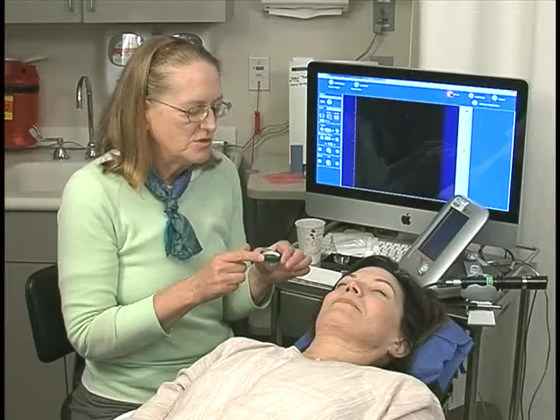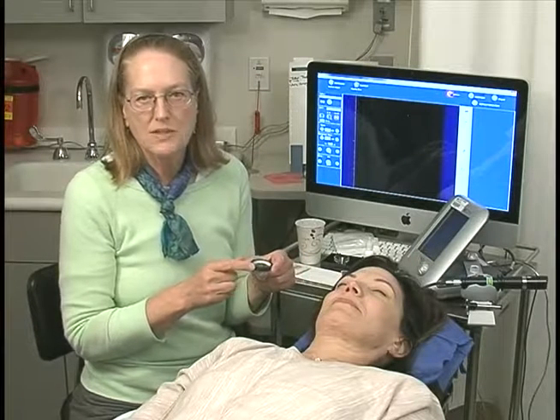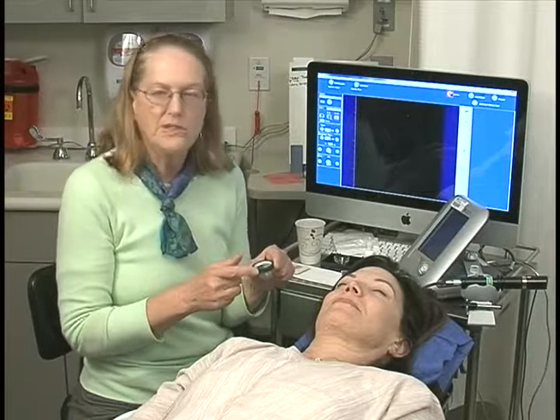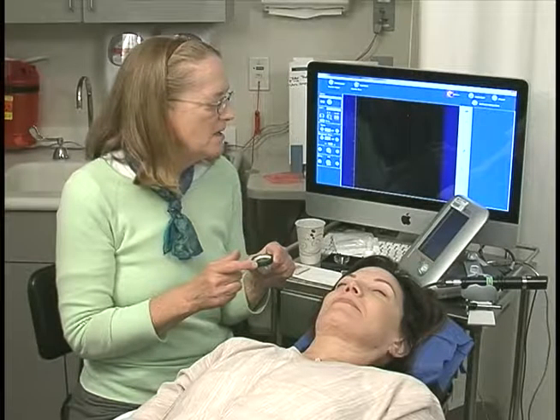Ultrasound biomicroscopy uses all the same principles as any type of ultrasound, but we have a little bit of a different examination technique.